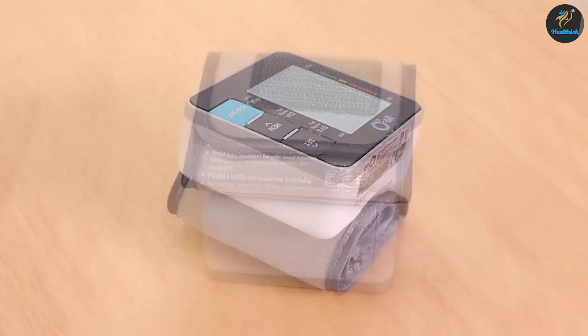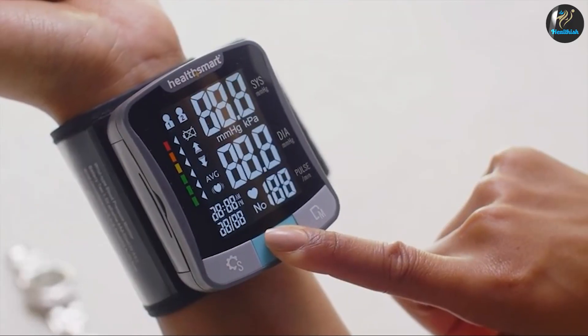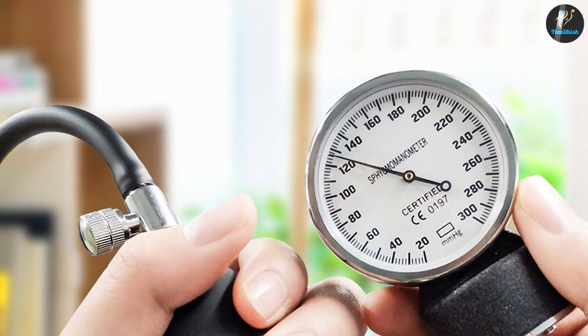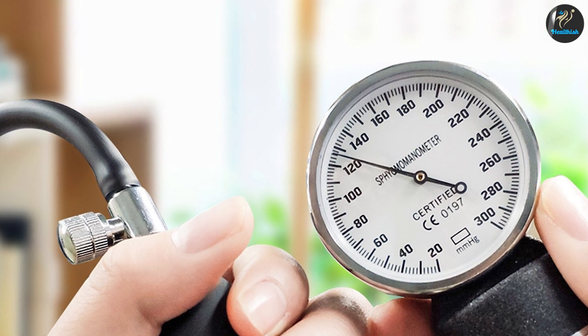There are also some automatic monitors that can be operated by batteries, which may be a consideration for people who do not have access to electricity. More doctors are encouraging their patients to use home blood pressure monitors to monitor their blood pressure on a regular basis, making it easier to do so.